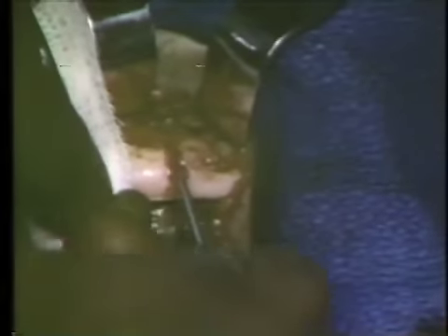As we indicated earlier, there are less arduous ways of removing bone these days. Rotary instrumentation with high speeds and newer devices has greatly simplified this operation that is being performed here carefully, but rather laboriously. The same anatomic consistency of the tube-like canal is demonstrated. Slightly less bone is removed from this side, as calibrated out in the model study.